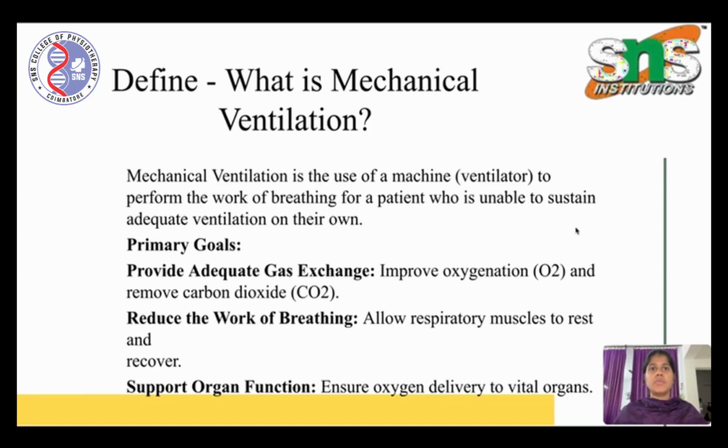So, define what is mechanical ventilation. It's a machine, a ventilator, performing the work of breathing for patients who cannot sustain it on their own. The primary goals are to provide adequate gas exchange, improve oxygenation and remove carbon dioxide, reduce the work of breathing to let respiratory muscles rest, and support organ function by ensuring oxygen delivery to vital organs. So this is the foundation of ventilator support.